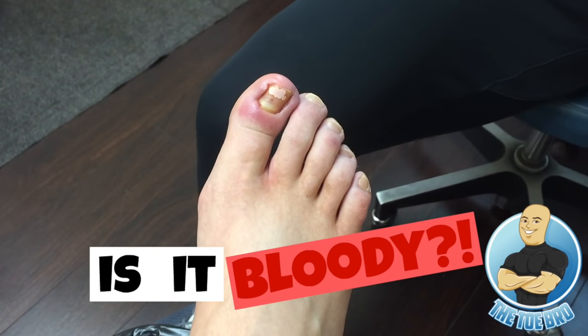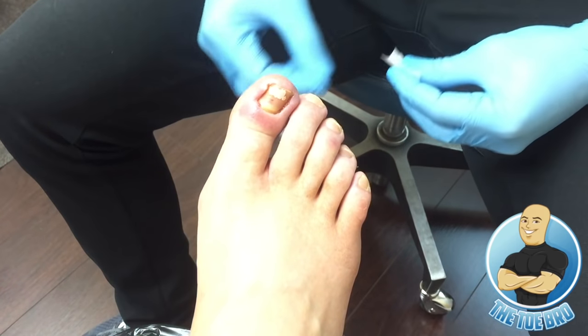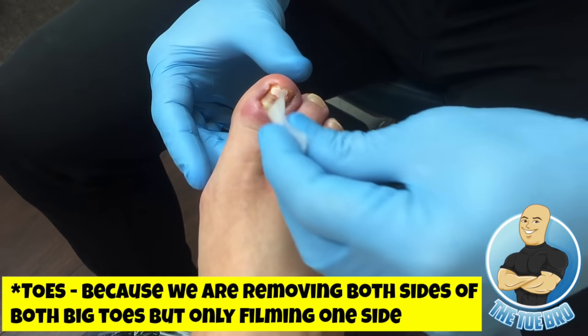Okay, so I'm just gonna wipe down the toe. Is it bloody? No. There's no blood because I put on a little rubber band around it, so there's no blood. Okay, so I'm just gonna wipe down the toes.